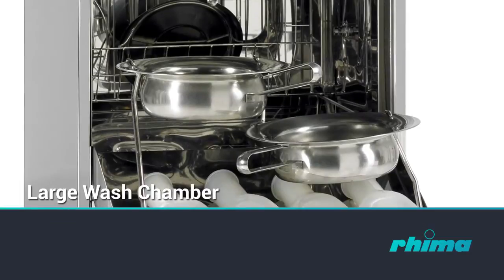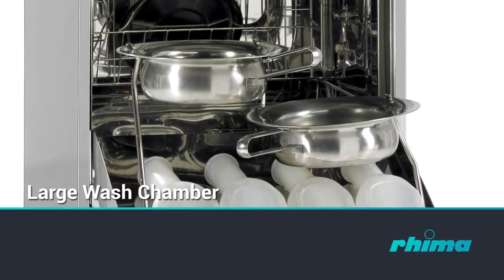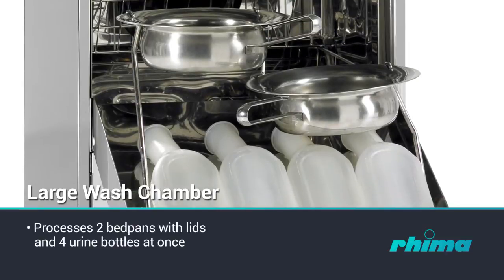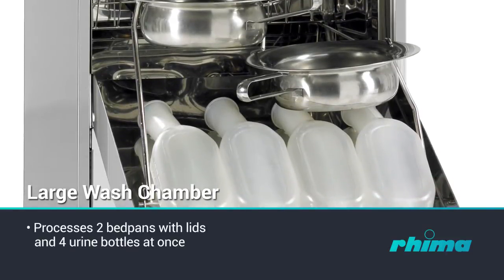The Deco 190 has a large wash chamber and capacity for automatic emptying and processing of two bedpans with lids and four urine bottles simultaneously.